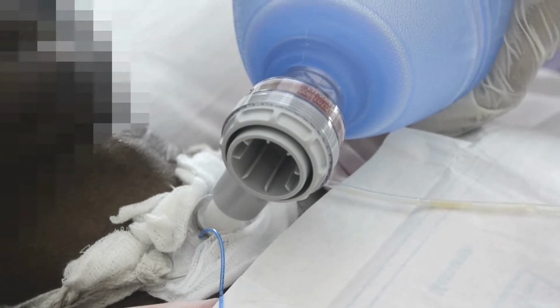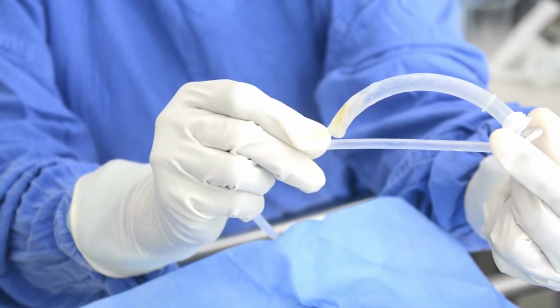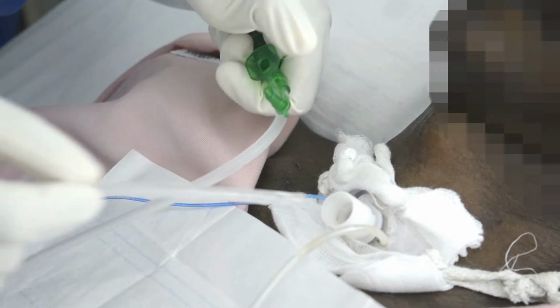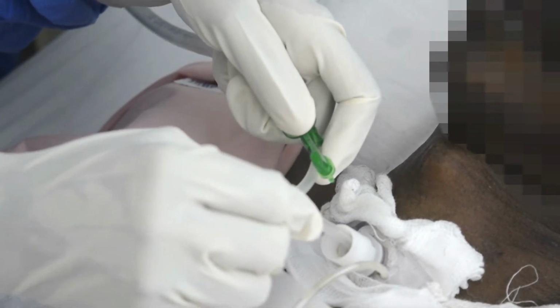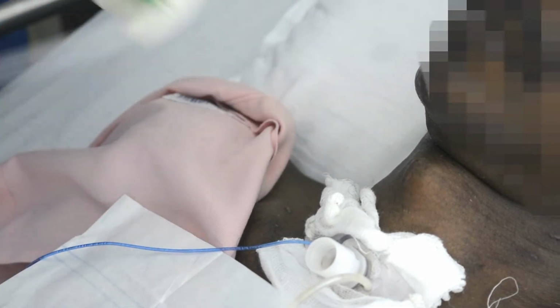Carefully take out the ambu bag. Measure how much of the suction catheter should be inserted, that is the length of the inner cannula. Then watch when she applies the suction pressure, that is at the time of withdrawal only.